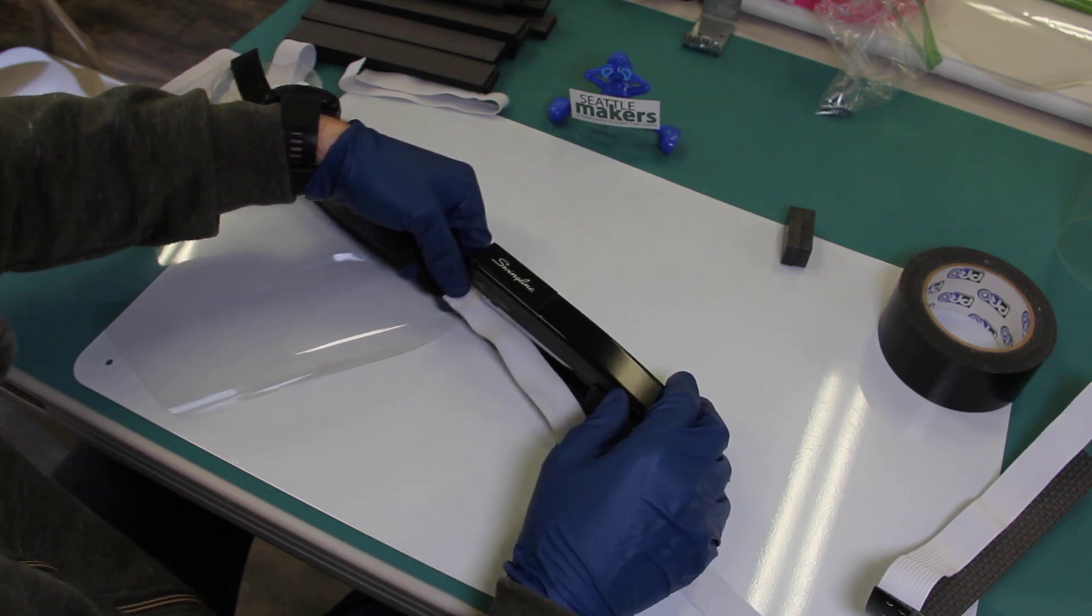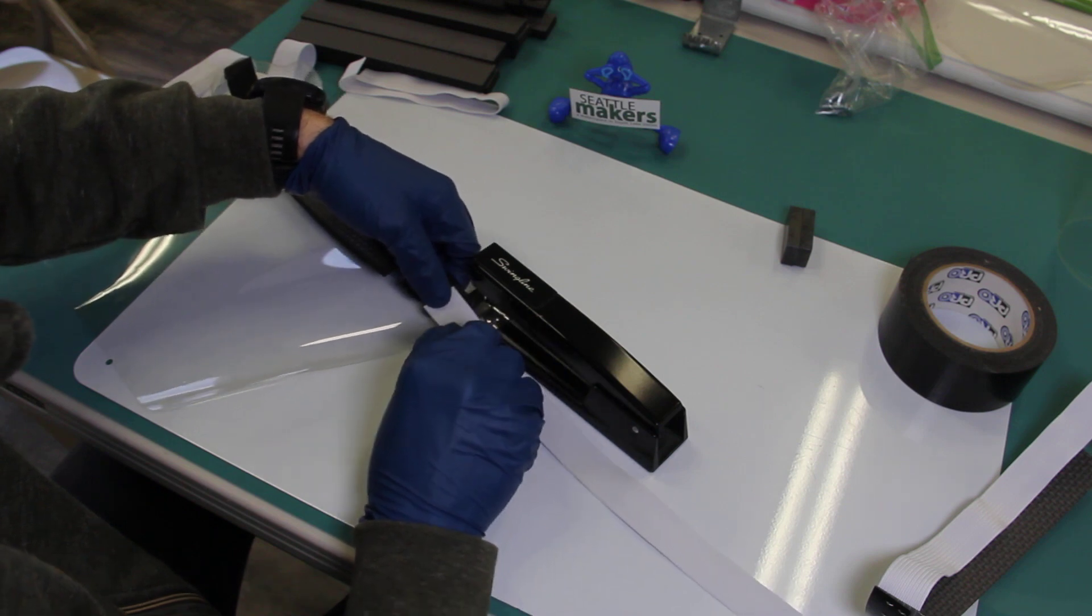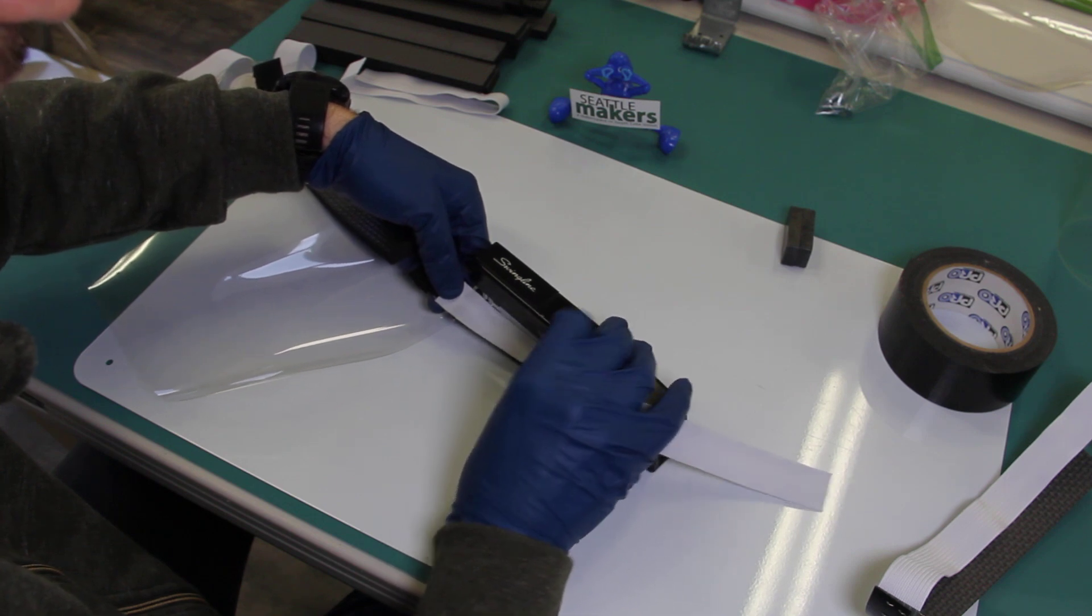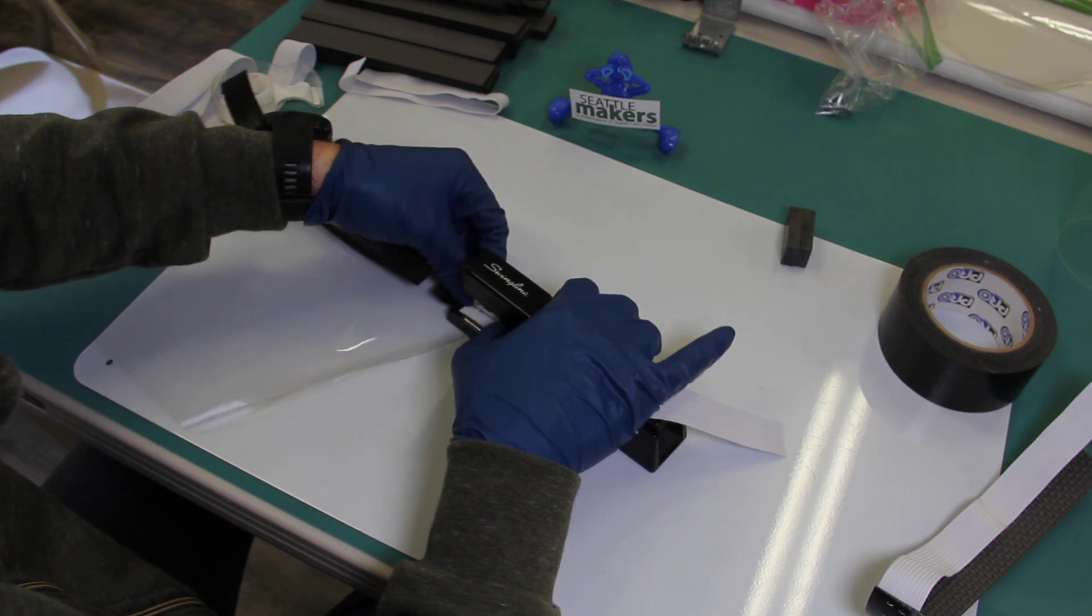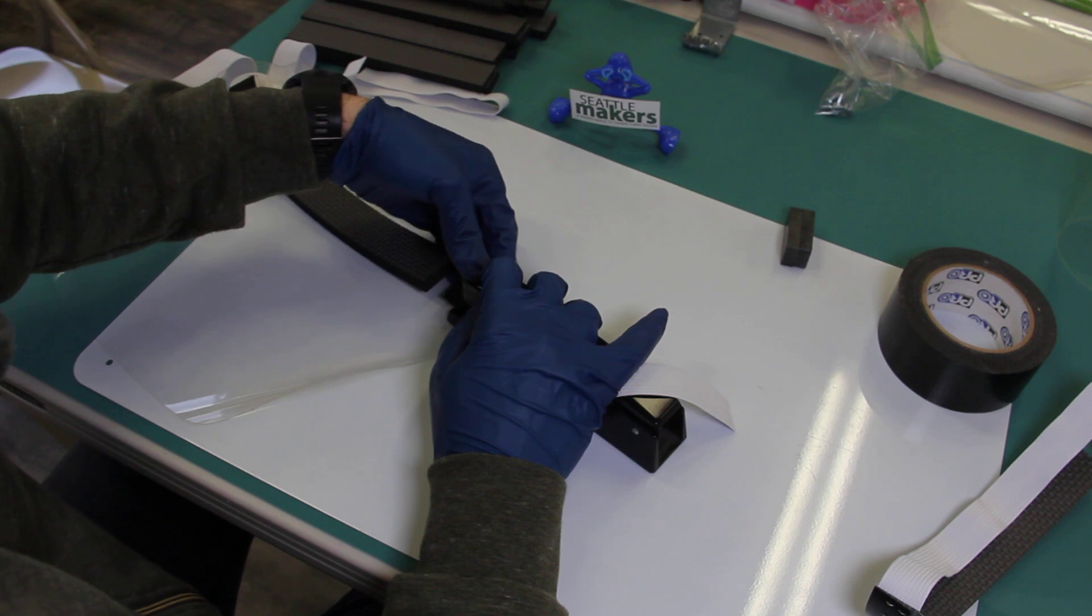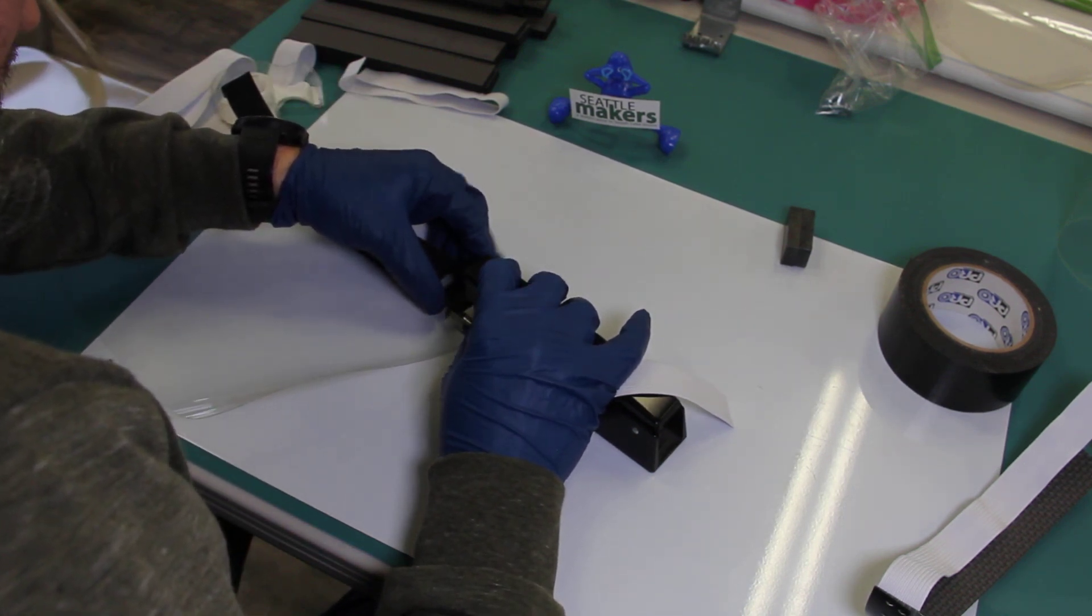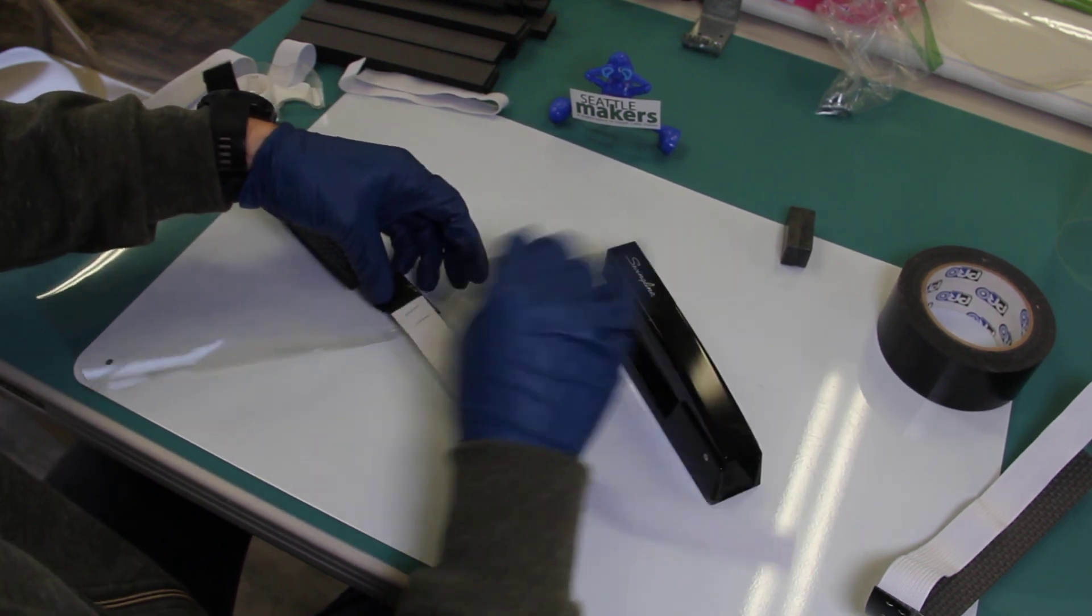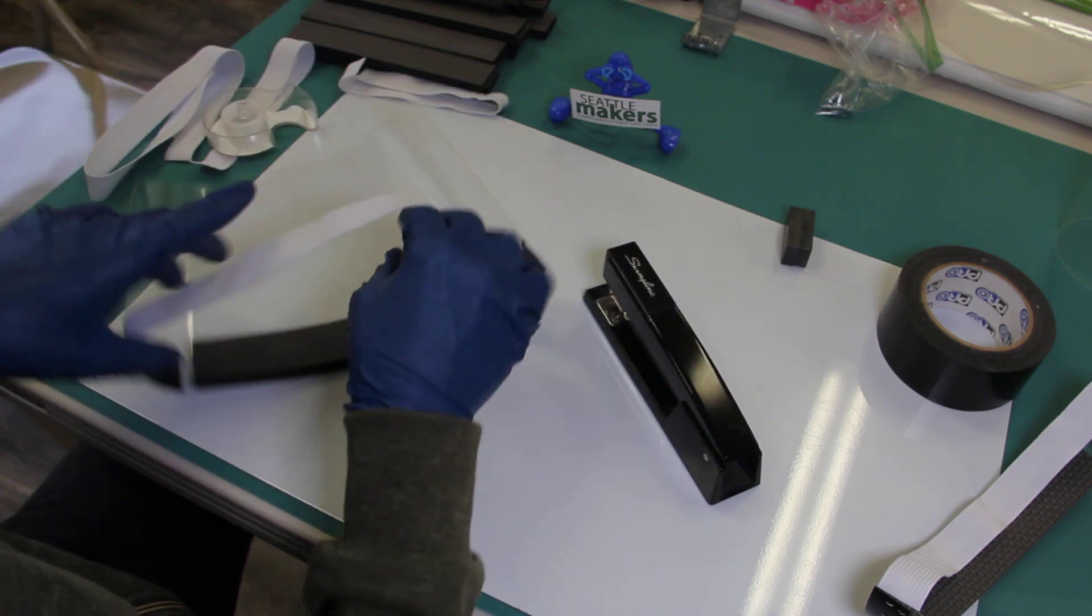The biggest issue here is going to be it wanting to bend that way. So you want to start by just putting some force and pushing this into here. That's going to make lining this up a whole lot easier. And then we'll do the same on the other side.